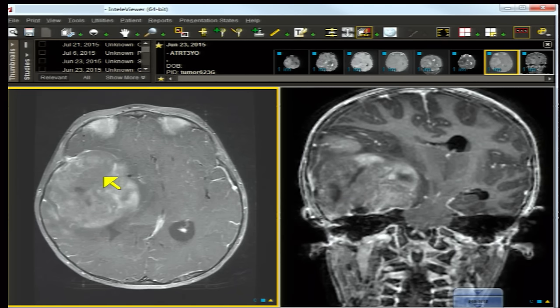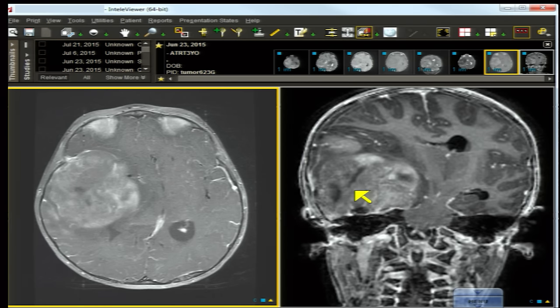The axial T1 contrast image and the coronal inversion recovery contrast image further support the diagnosis of an intra-axial parenchymal mass. It would be highly unlikely to have an extra-axial mass of this size in a young infant.